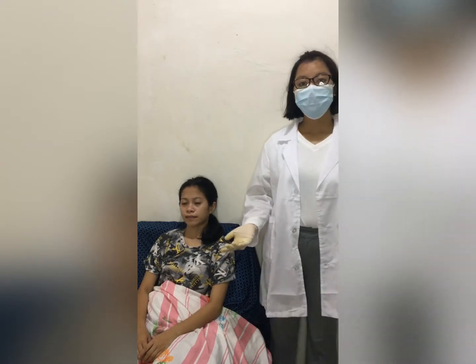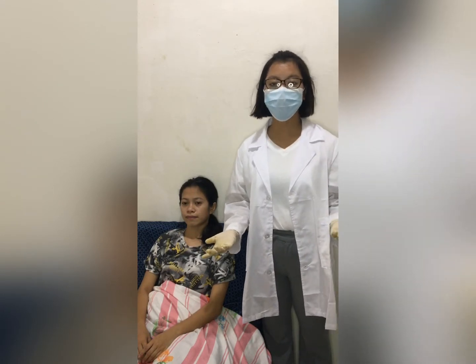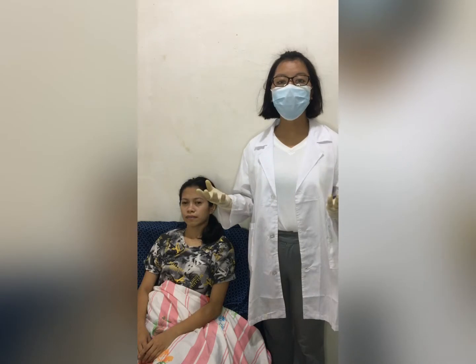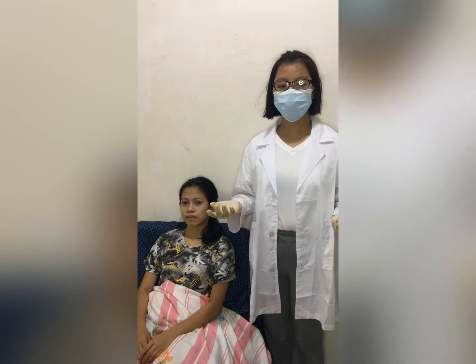Then after, inspect the nasal cavities using a flashlight or a nasal speculum. Since I do not have a nasal speculum, I will rather use a flashlight. If you have a speculum, the procedure is to hold the speculum in your right hand and inspect the client's left nostril, and in your left hand to inspect the client's right nostril.